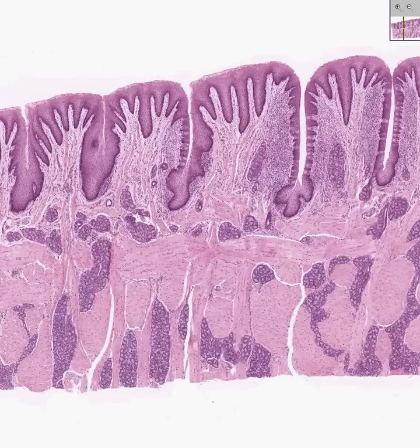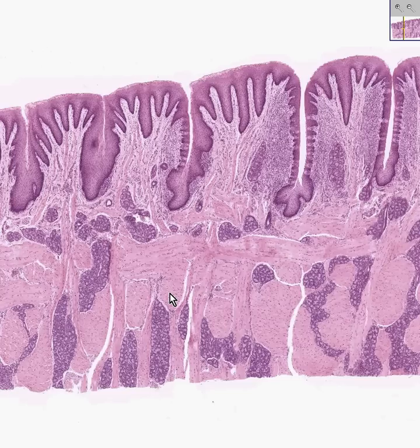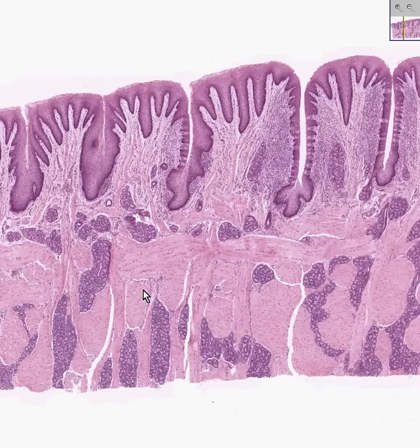You can absolutely identify this as another section of tongue for the same reason as our previous case of circumvallate papilla. You can see serous glands all throughout here — all these blue structures are serous glands. They're bluish and they secrete serous fluid.